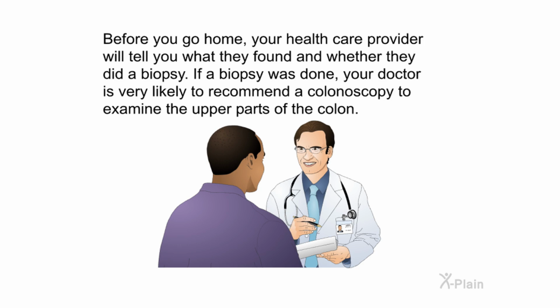Before you go home, your healthcare provider will tell you what they found and whether they did a biopsy. If a biopsy was done, your doctor is very likely to recommend a colonoscopy to examine the upper parts of the colon.